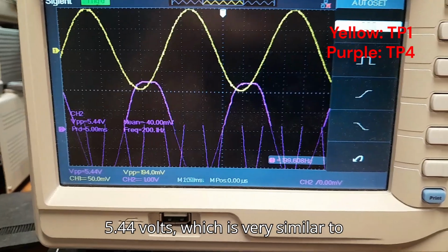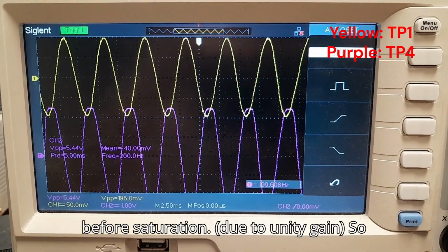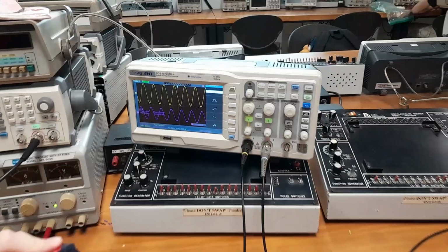which is very similar to the output voltage we got at stage 2 before saturation. So if you're wondering, yes, the trimmer from stage 2 will also be able to adjust the waveform at TP4.